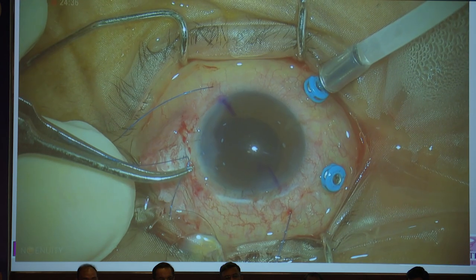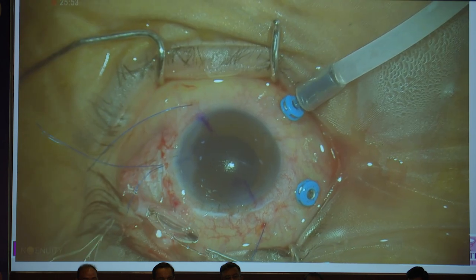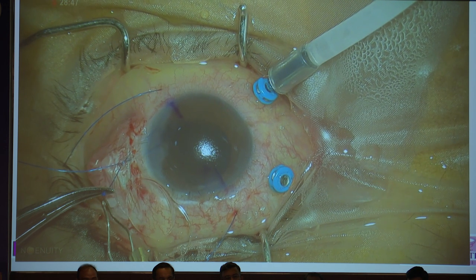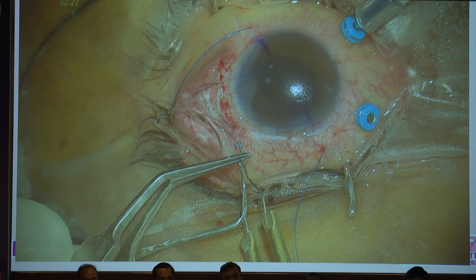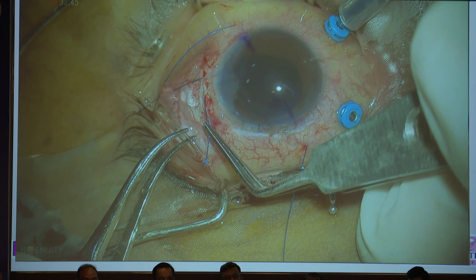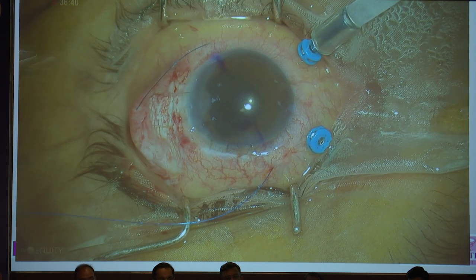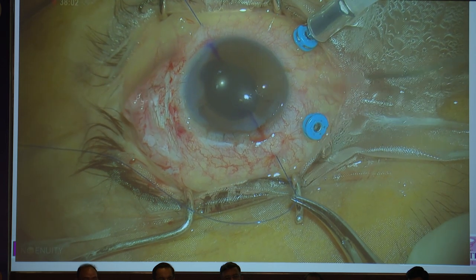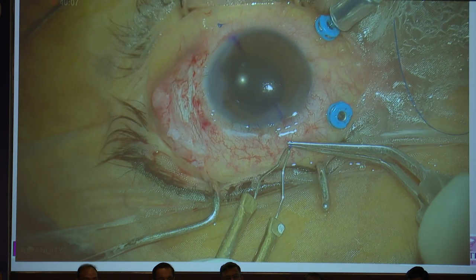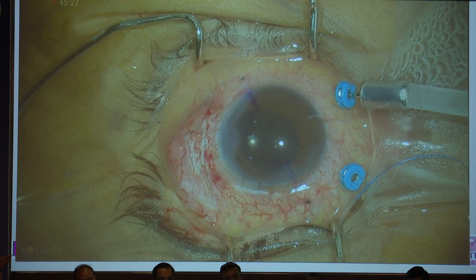So as you bring it out, I just pass it on to the eyelet of the scleral fixated IOL. And now you can see here, I'm just trying to make a flange with a Bovie heat cautery. And once you make a flange, just try to pull it and see, because it should not slip away from the eyelet. Once it is confirmed from both sides, just insert it inside, pull it on both the ends, and you will have a very good centration. Then just cut it, and to whatever extent you can have the centration, just heat it. Now you can see a very well placed lens.